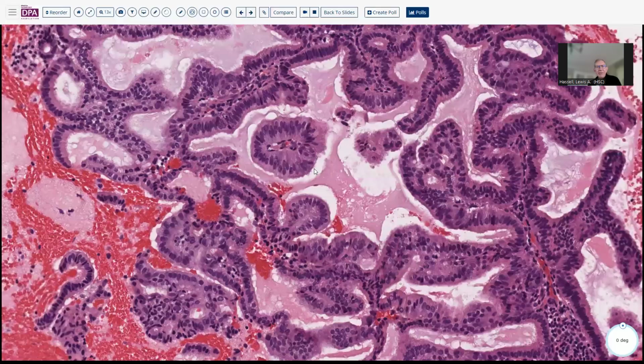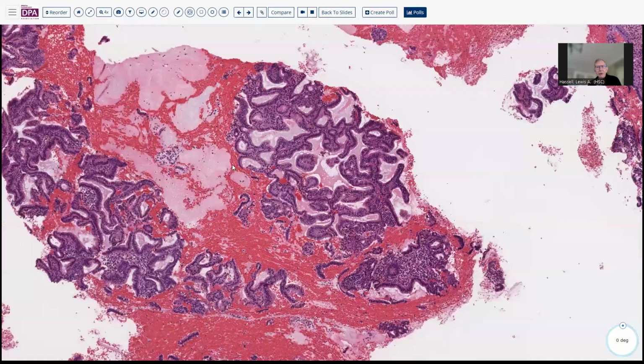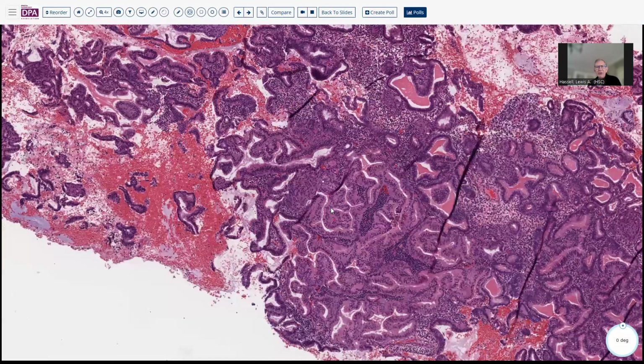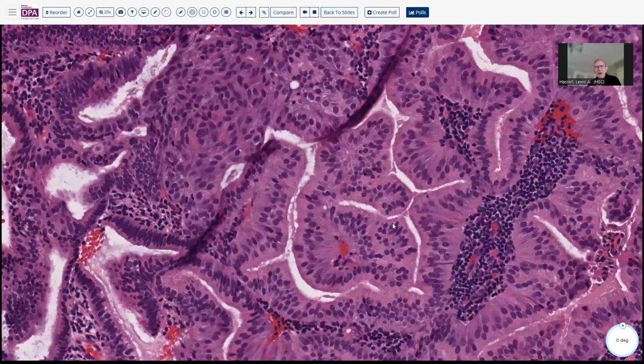Additionally, intraluminal necrosis or areas of necrosis, while not entirely specific, are certainly more suggestive of endometrial carcinoma over endometrial hyperplasia. And then finally, high degrees of nuclear atypia, grade 3 nuclei, and so forth should certainly raise a greater consideration for endometrial adenocarcinoma. And you can see here these cells, tall, big cells, but fairly bland, low-grade appearing nuclei.